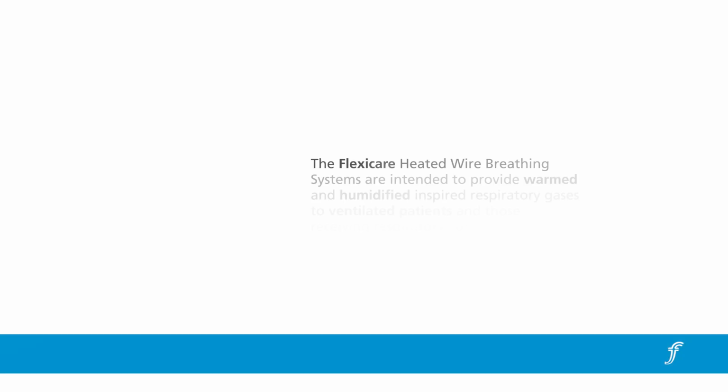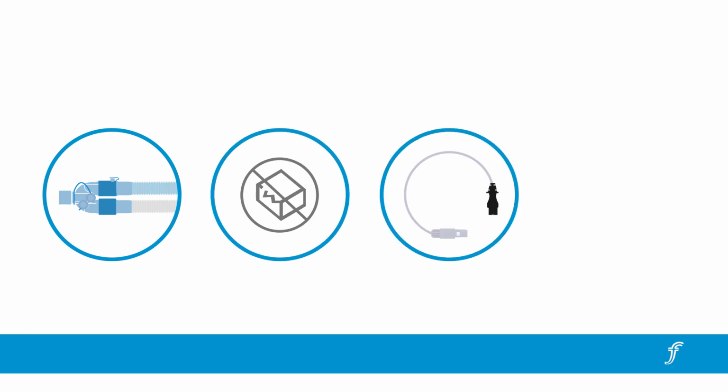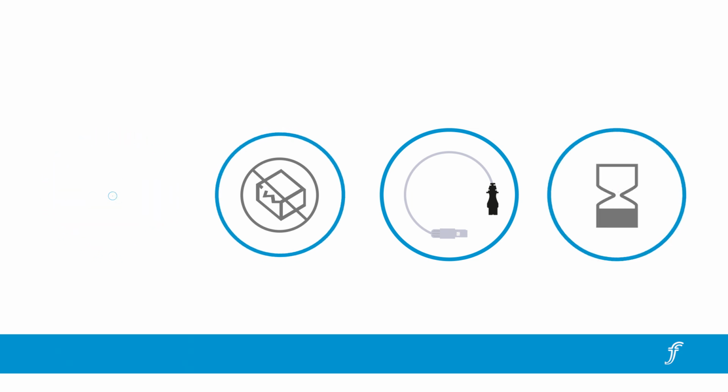The Flexicare heated wire breathing systems are intended to provide warmed and humidified inspired respiratory gases to ventilated patients and those receiving respiratory support. Before opening the sterile packaging, check that the breathing system is the correct type, the packaging is not open or damaged, all parts are present and intact, and the expiry date has not passed.